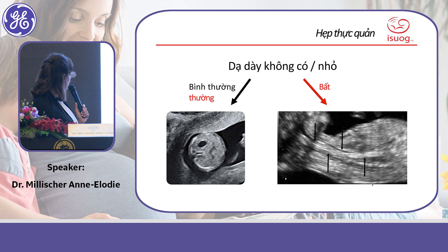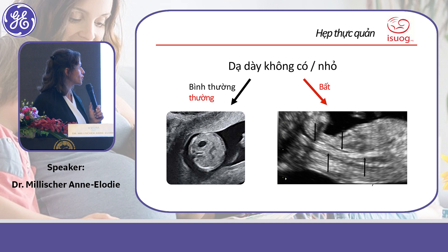On this figure, you can see regurgitation of the fetus due to esophageal atresia. With Doppler, you can see the flux just inside the amniotic fluid, illustrating those regurgitations.